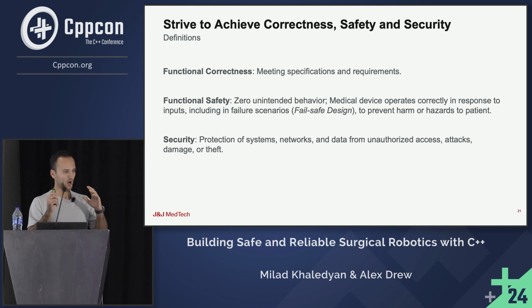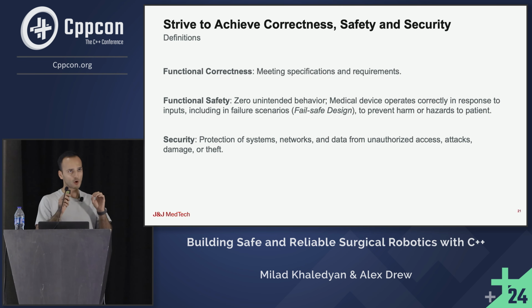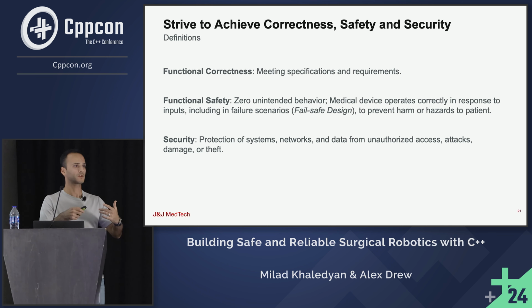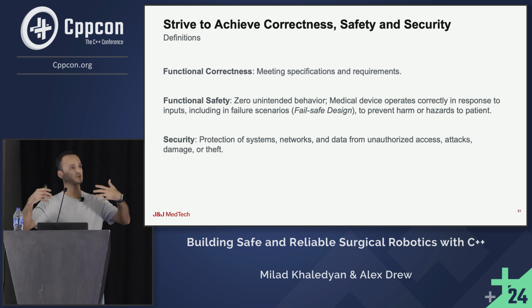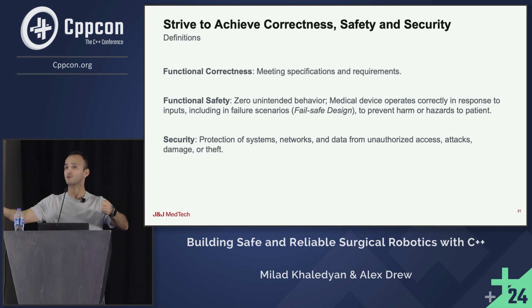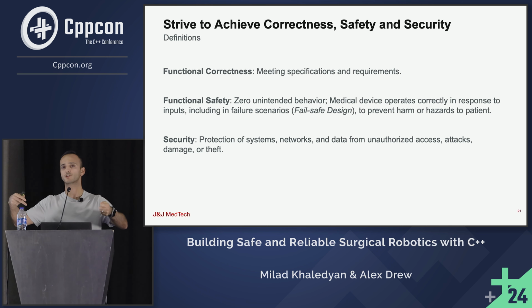So what do we want to achieve from a software as medical device perspective? We want to achieve functional correctness, functional safety, and security. What is the definition of functional correctness? In my opinion, you have a product, you have some specification, you have input and output in a deterministic way. If you can validate and verify the specification of your system, then your system is functionally correct.